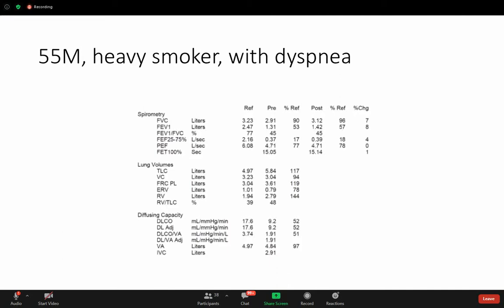No. Yeah, it is actually significant. That means there is a lot of air inside the lung. What's next? So we know that there is an obstructive pattern now. Okay? So how to differentiate between asthma and chronic bronchitis versus emphysema?